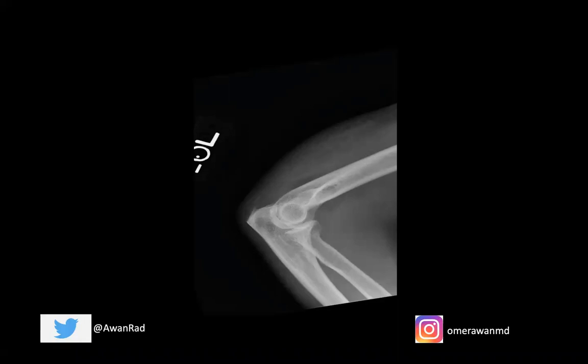Hello everyone, and welcome to case number nine in the MSK Unknown Case Series. This week's session, we have a lateral view of the left elbow, and we can see that this is a nice lateral view. We can identify the distal humerus, the proximal ulna, and the radius.